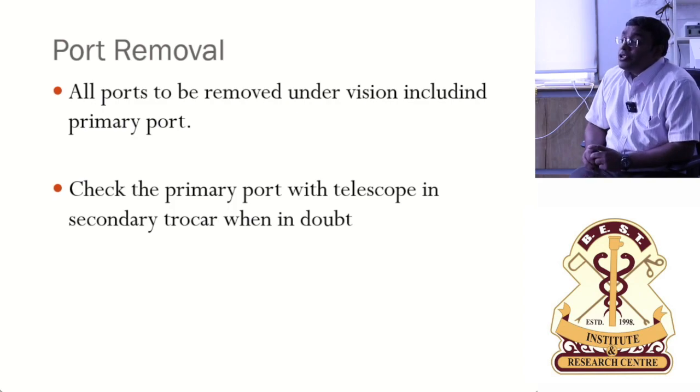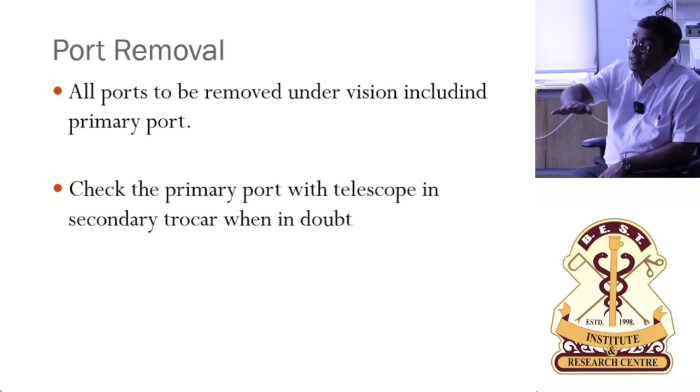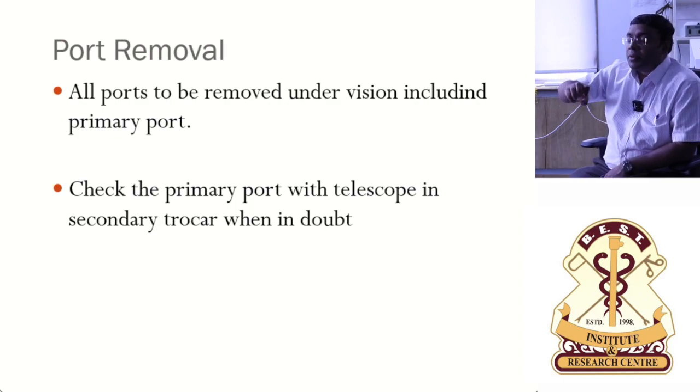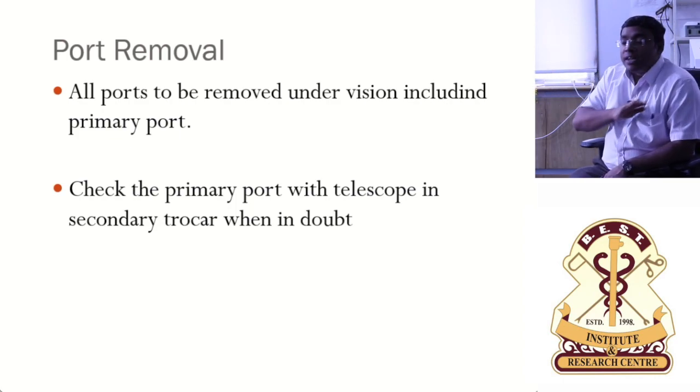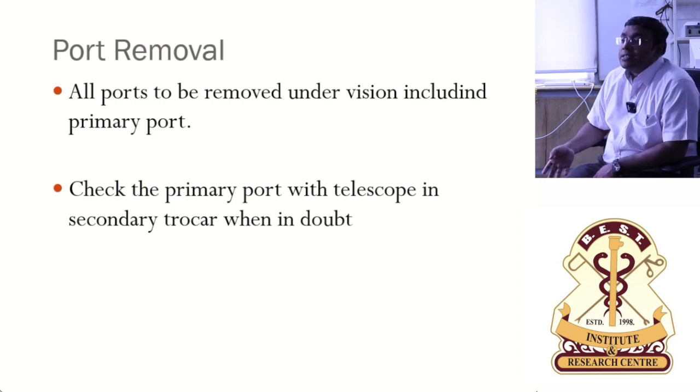Yes. To ensure complete desufflation of the abdomen, the patient has to come back to supine; only then will the gas come out through the optical trocar completely, or else it will not. So those patients will have shoulder tip pain if some amount of gas is left behind.